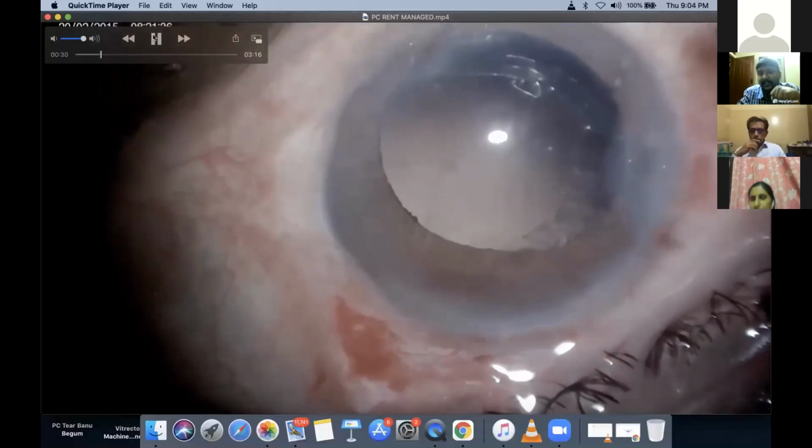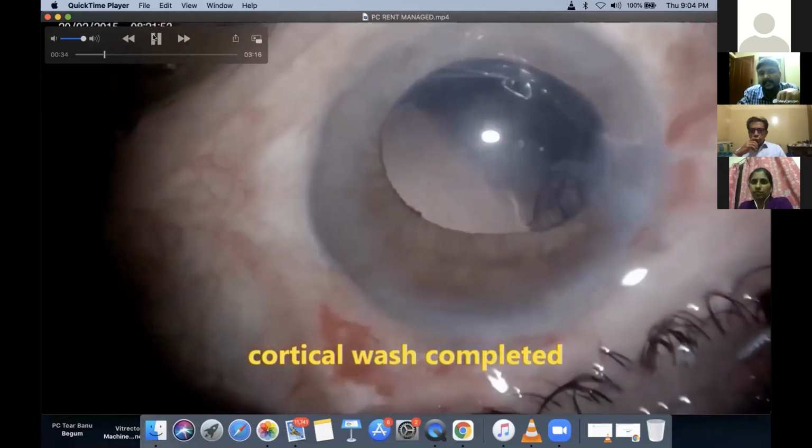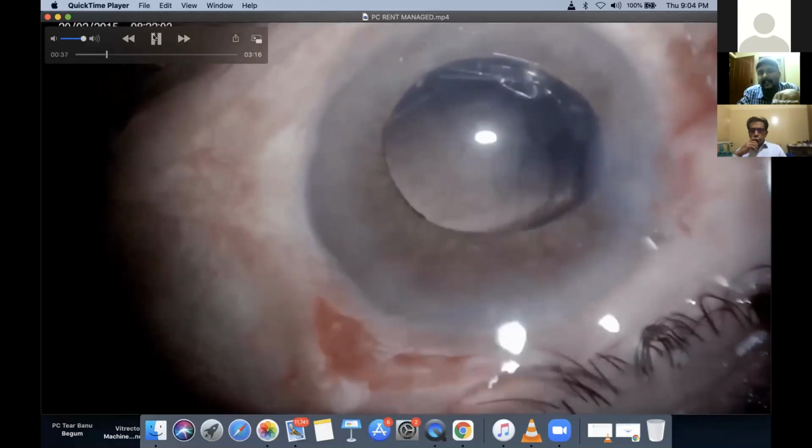At this point of time, sir. And so what was done is, yes, Visco was utilized and a cortical wash was done.